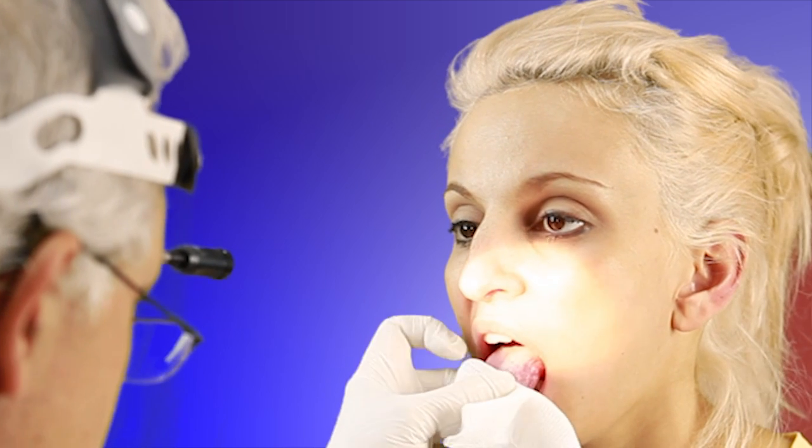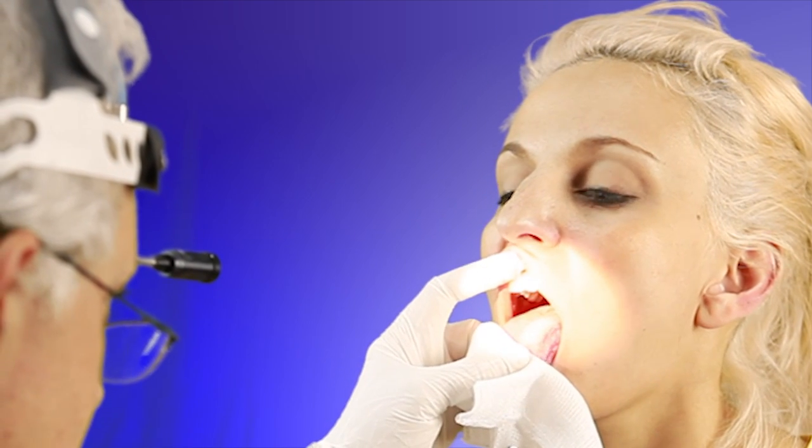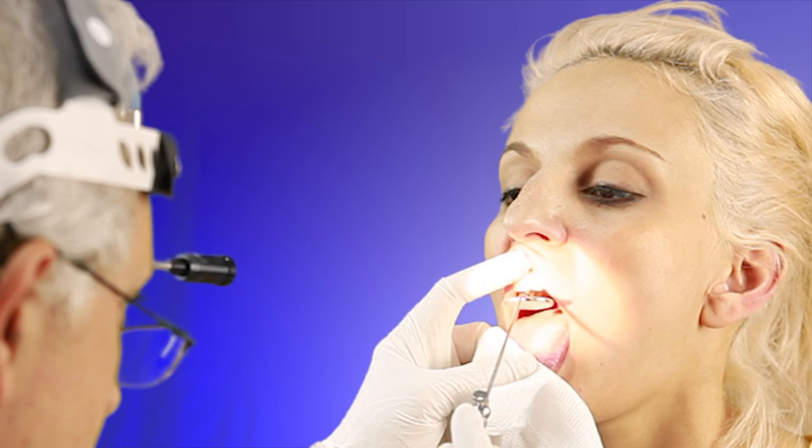Use a mirror and a headlight. Pull out the tongue of the patient using a gauze, and try to inspect the larynx and hypopharynx.